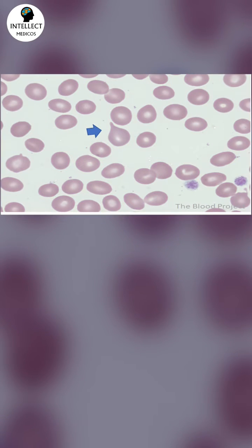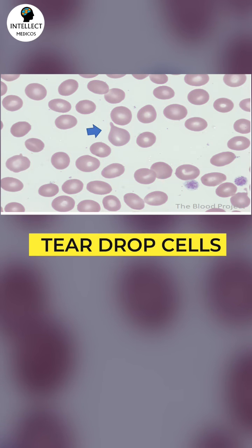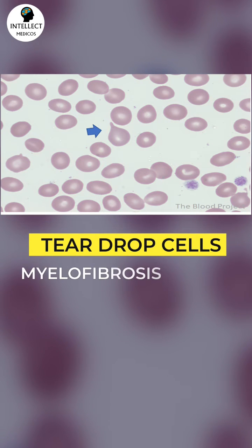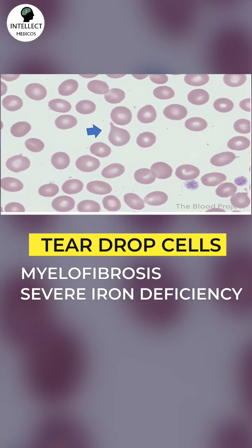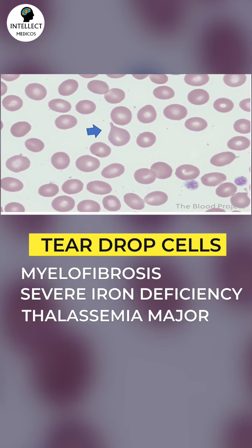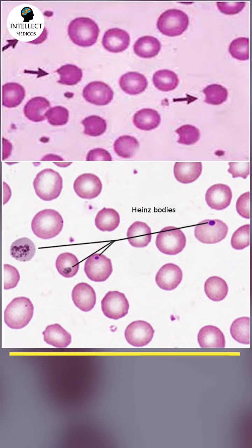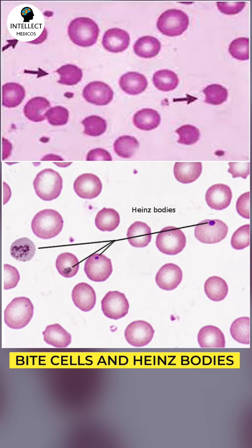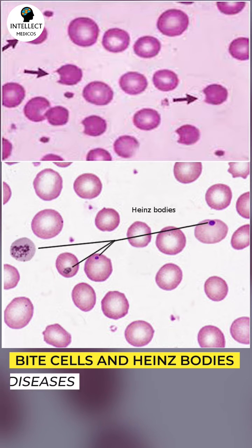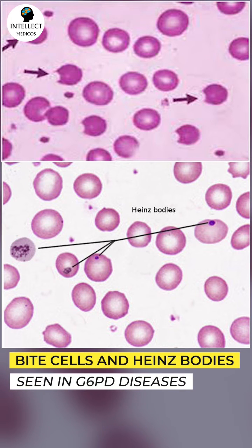The first slide shows tear drop cells, which are commonly seen in myelofibrosis, severe iron deficiency anemia, and thalassemia major. The second slide shows bite cells, and you can also see Heinz bodies, which are very typically seen in G6PD disease.